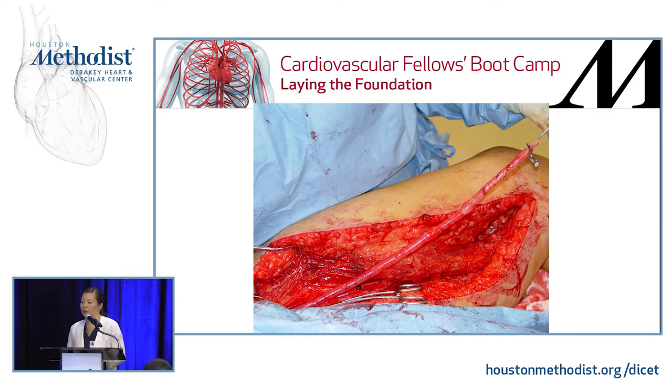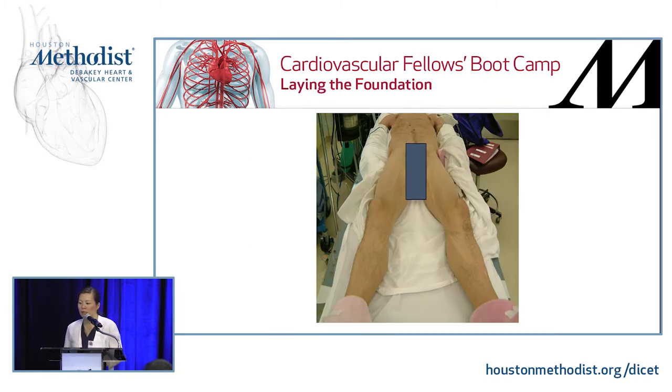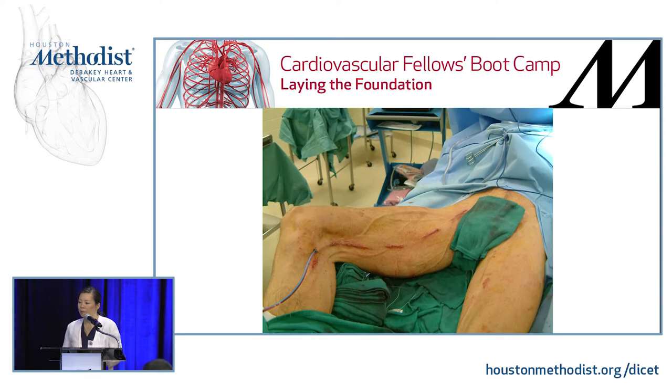Here's another guy that we did. Very skinny. Aren't those nice veins? You never get those patients. And then we do skip incisions and we leave a drain. Recovery's not too bad. Sometimes they'll get a lot of leg swelling, and so we'll put a compression stocking on them afterwards.